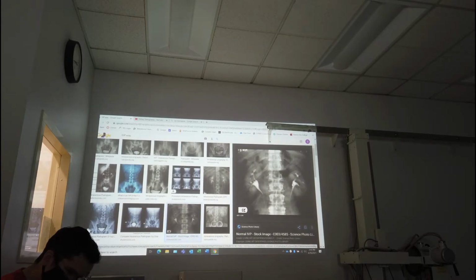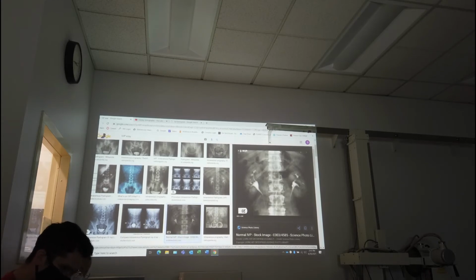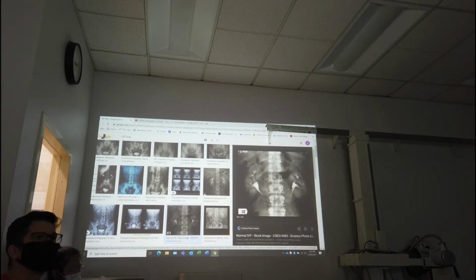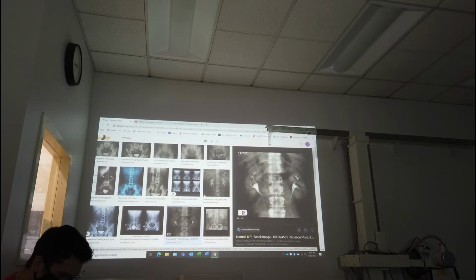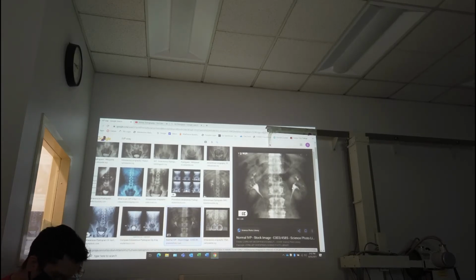Like the CT injectors that you guys see, those are really quick, rapid injectors. It's a bolus injection. That contrast is very viscous, it's real sticky, and it's not easy to push. I see some people shaking it, sometimes they'll put it against their hip. Is that why it helps to warm it up? Yeah, it's because it's less viscous, it's less sticky. So it's not easy to push, especially when you have a small needle or a small catheter. So a lot of times it's just not very easy.